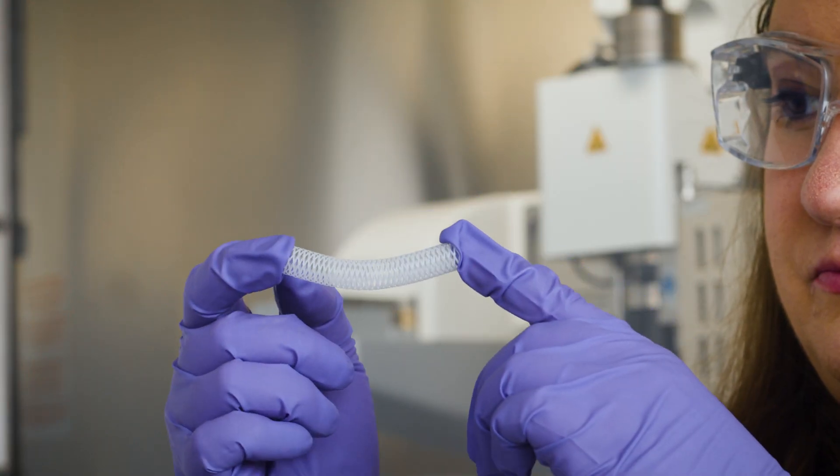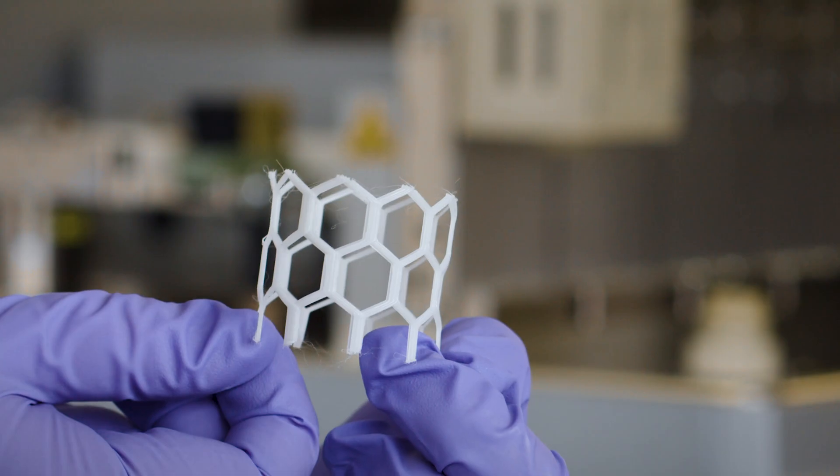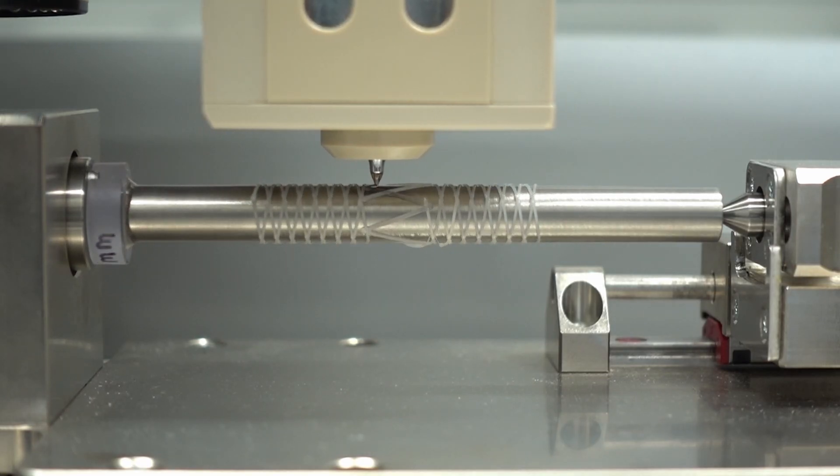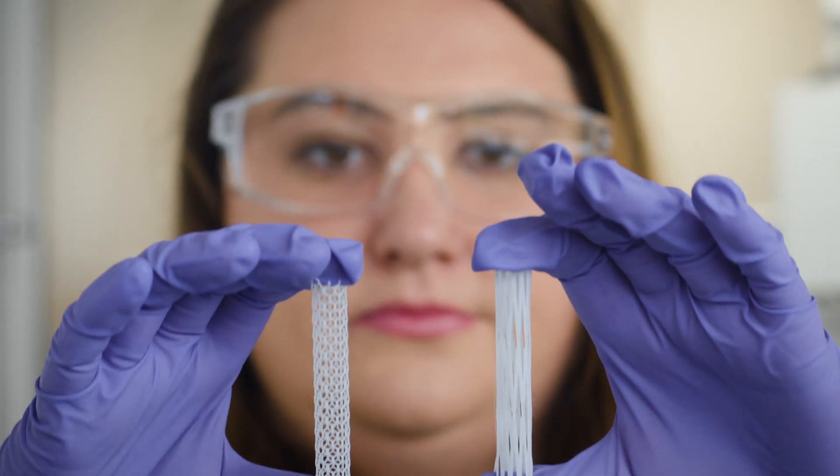The team at Desktop Health is excited to see all of the groundbreaking research and implantation-quality medical devices that will roll out from our customers using the Print Roll system for the 3D Bioplotter.